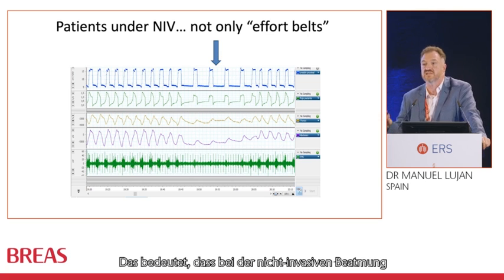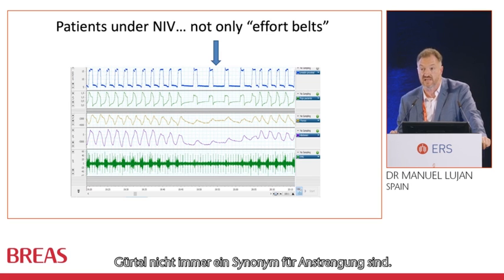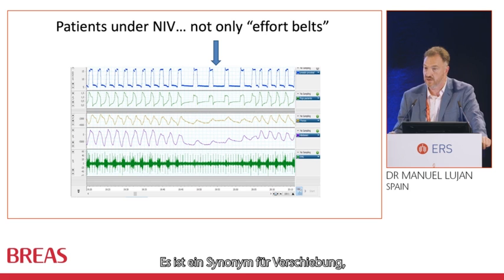The consequence is that in non-invasive ventilation, belts are not always a synonym of effort. It's a synonym of displacement, not always effort.